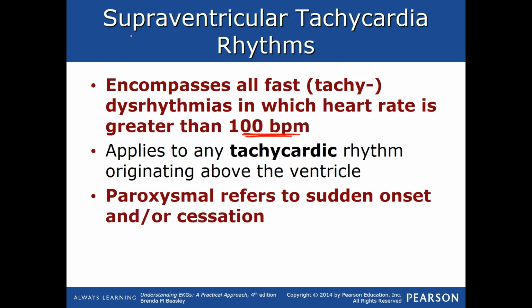So supraventricular tachycardia, okay? We understand tachycardia because it's 100 or greater. Supraventricular, meaning above the ventricles, right? So it's being paced in the atria. So we're just going to make some generalizations here that apply to any tachycardic rhythm originating above the ventricles.